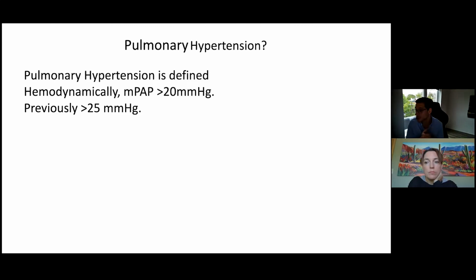But what we ask ourselves is, what is the driving cause of the pulmonary hypertension, right? Sure. And there's where we go towards seeing, first of all, the wedge. If it's more than 15, you can say it's due to a left-sided cause, and then you have to calculate a few other calculations. But by definition, this person has pulmonary hypertension. We need to figure out why, right?